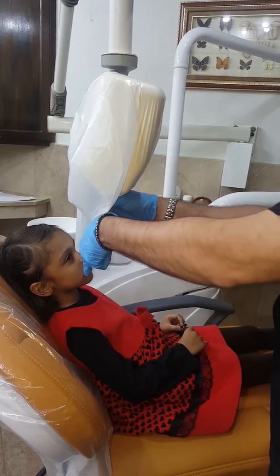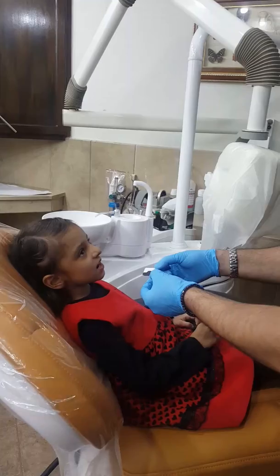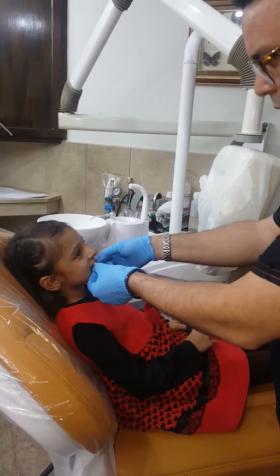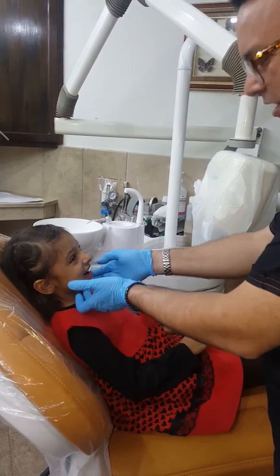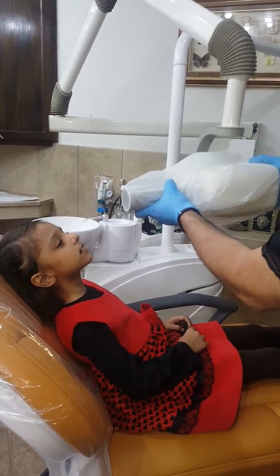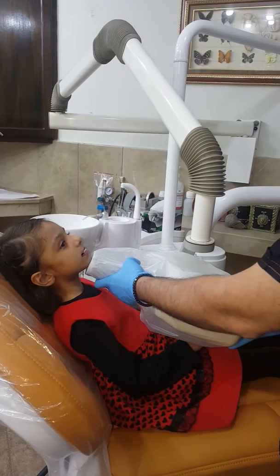For the lower arch, you open, close, and then you have the child tilt the head up. You bring the machine down from the bottom like this and expose it.